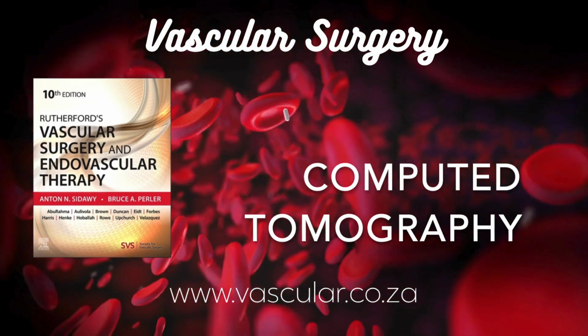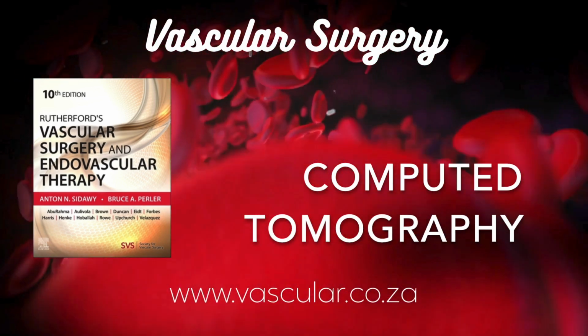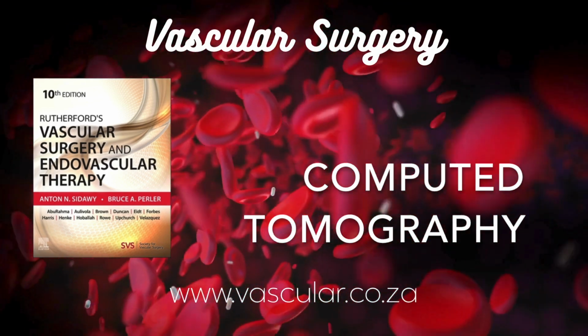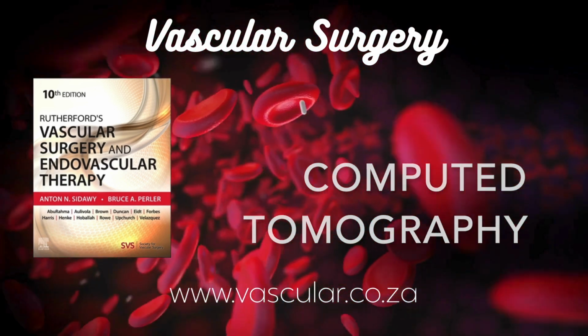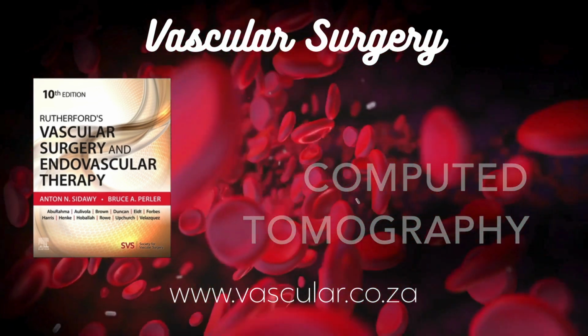What else? Beam hardening is a big one, especially with metal. You get dark streaks or bands appearing near dense objects like prosthetic hips or metallic stents. Can that hide problems? Definitely. Those streaks can obscure anatomy right next to the metal, and the artifact itself can sometimes be misinterpreted or make a stenosis near a stent look worse than it is.